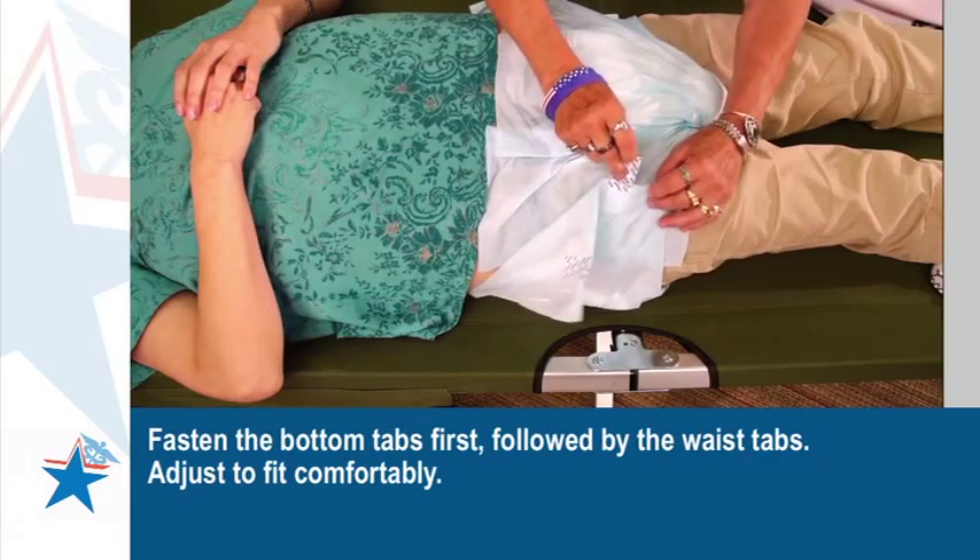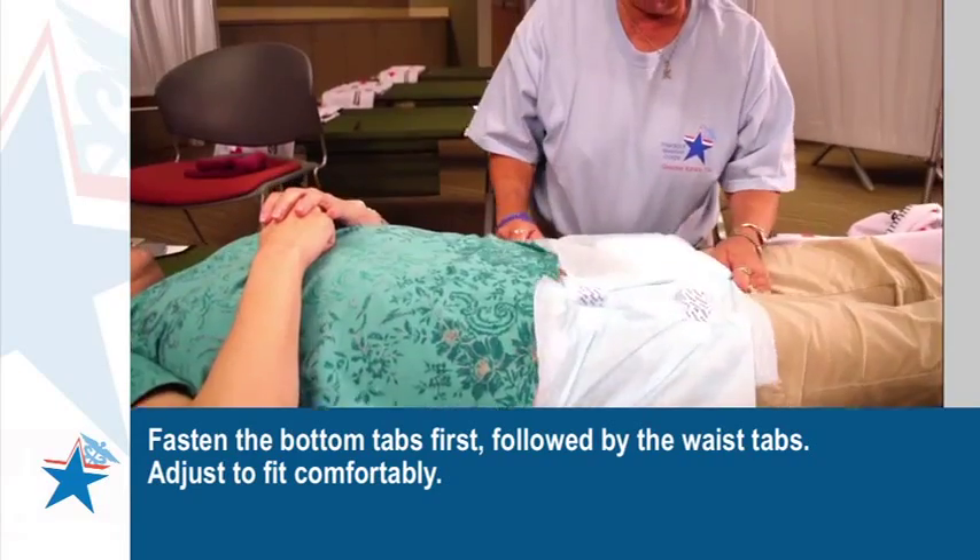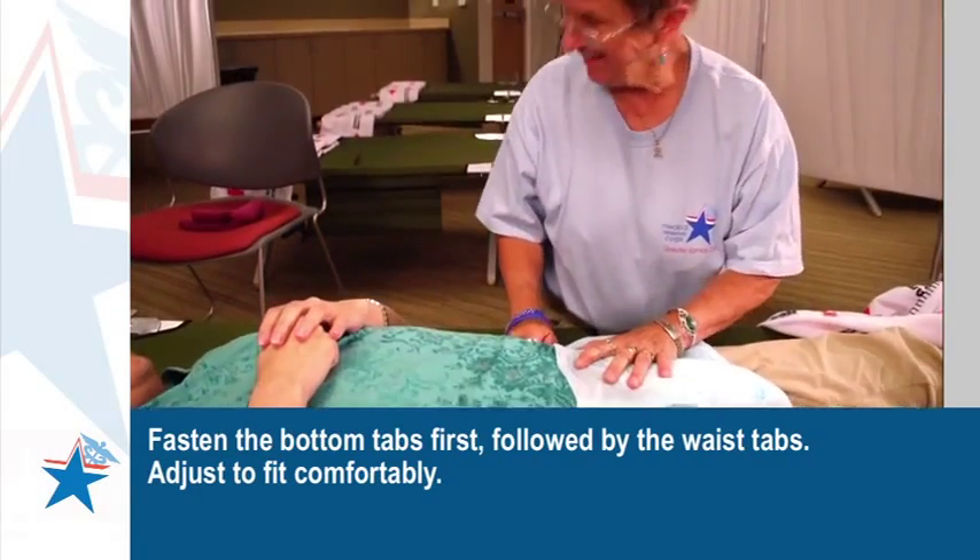Fasten the bottom tabs first, followed by the waist tabs. Adjust to fit comfortably. Is it comfortable?